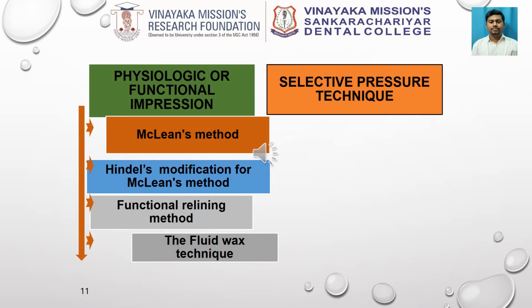Many authors have come up with different ways of physiological or functional impression techniques, but MacLean's method, Hindel's method, functional relining method, the fluid wax technique, and the selective pressure technique are the most commonly used in the day-to-day scenario.